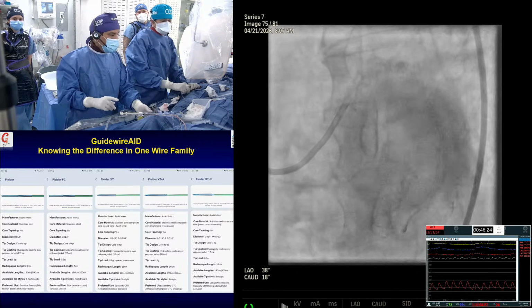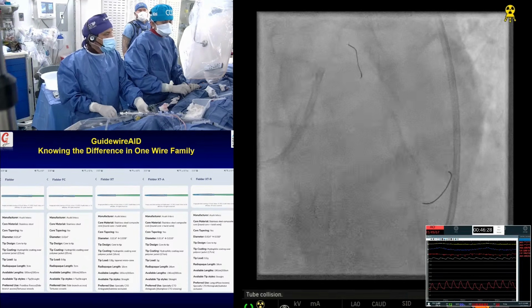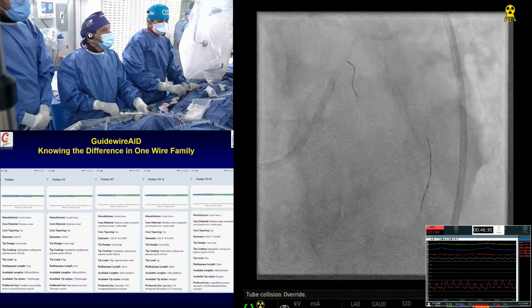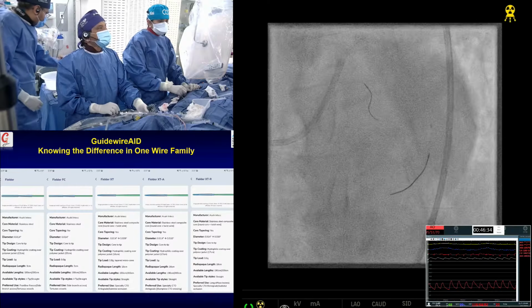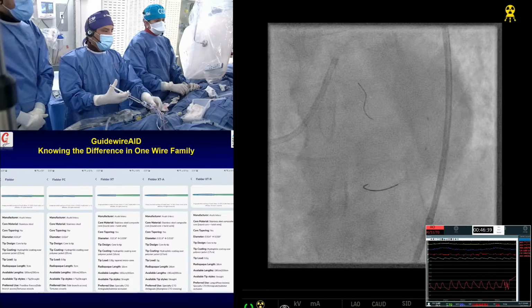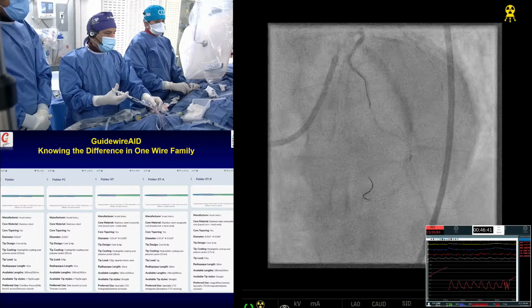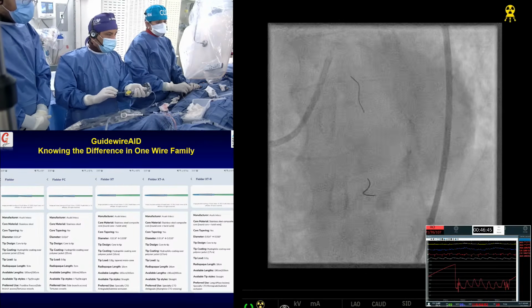Okay, go to this view exactly then. This is the view of 38 to 18. I can tell you, I don't remember the patient's history if he was having a severe angina, but the circumflex mid lesion is the culprit, definitely. Such a large dominant vessel, we'll be surprised how big the vessel becomes. There you go, distal circulation. This is the one.